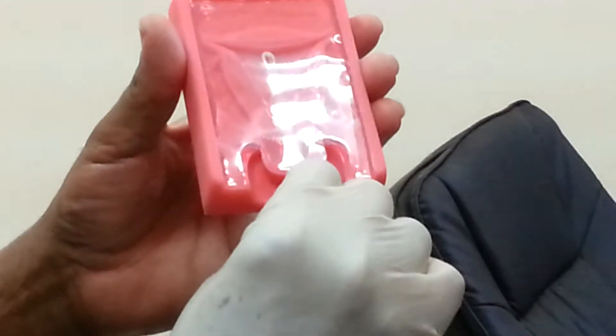Usually this marker will determine the length of the uterus. Then after that, this plunger will be inside.